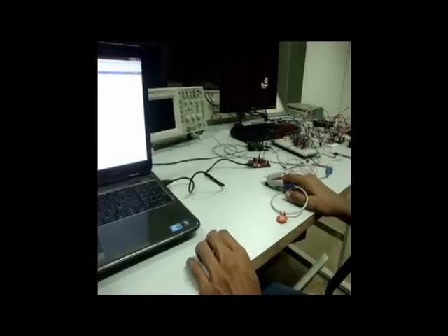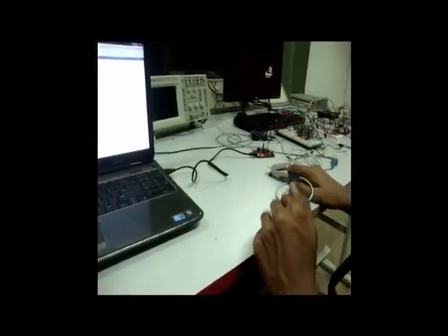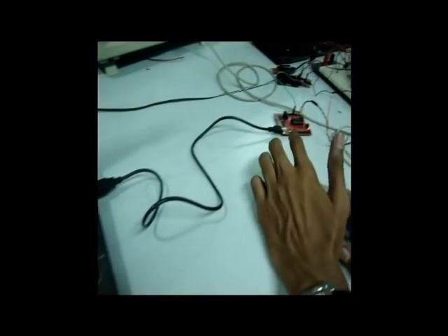Now we will be using a more cost-effective solution to display the PPG waveform on the PC. We will be using an MSP430 launchpad, which communicates with MATLAB using the back channel application UART. Now when I send a request to MATLAB to display the PPG waveform, MATLAB is able to display the PPG waveform on the basis of the samples collected in the last 5 seconds.